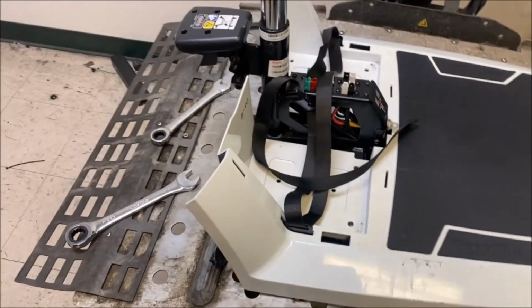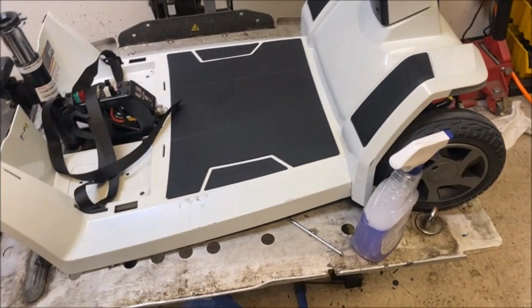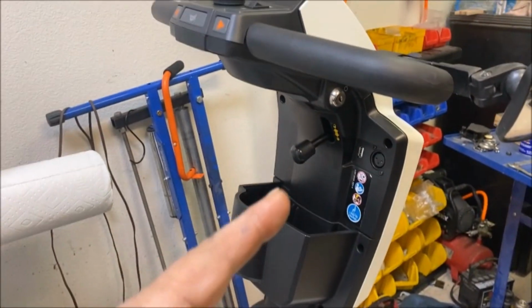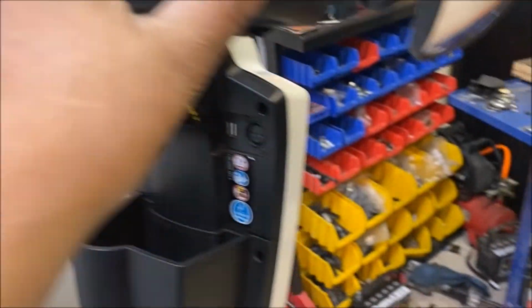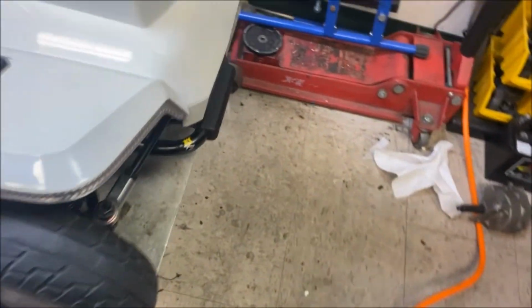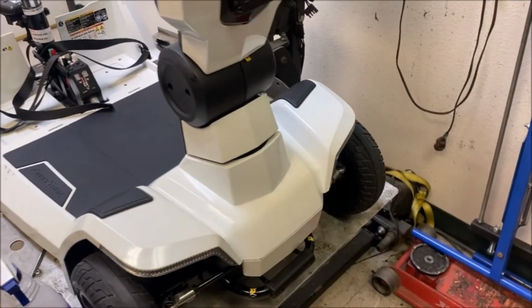Okay, front section's all done. I've greased everything and I've put Loctite on every nut that's needed. I checked all the screws. There's a couple of loose screws in the top console. Dusted out the top console, a little bit dusty in there. But yeah, checked all the wiring, checked all the cable ties are all still there in place.